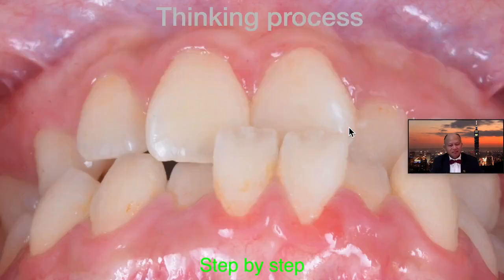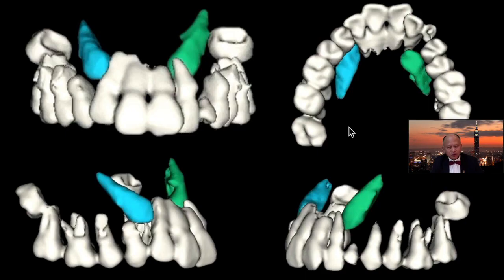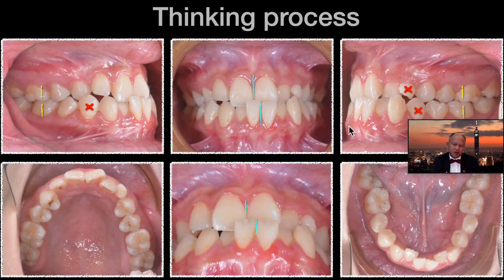Step by step, how do you fix this case? First and foremost, you need to have a reasonable treatment plan. Severe crowding with protrusive lower lip. We were thinking about 4-bicuspid extraction.